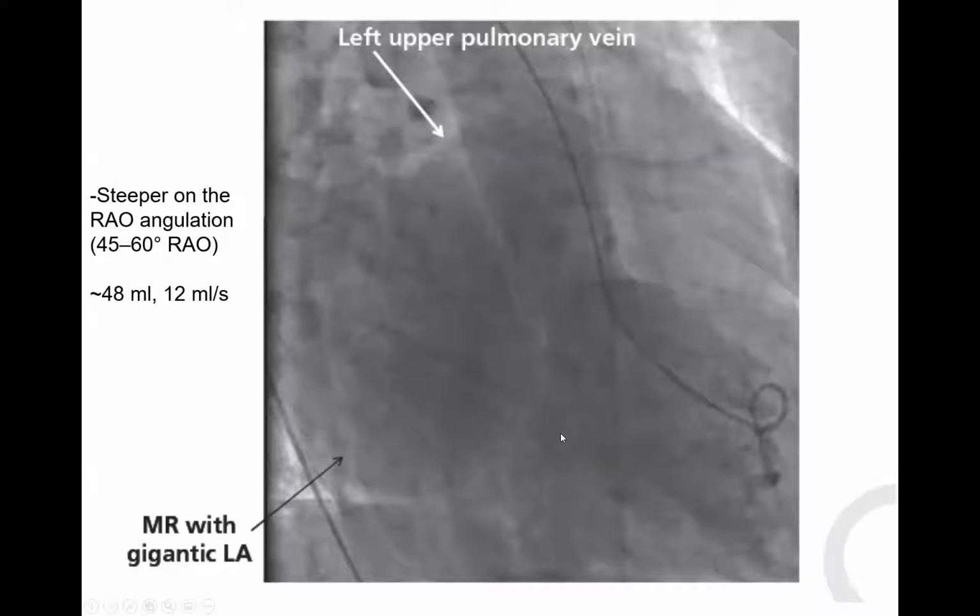Okay, now there is a technique to prove mitral regurgitation. I want to tell you that you need to know, even though we don't talk much about it, left ventriculogram is an excellent modality to assess regurgitant valvular disease, particularly cases that are indeterminate by echo. It's because it is a volumetric assessment. It's qualitative, but it's a volumetric assessment.